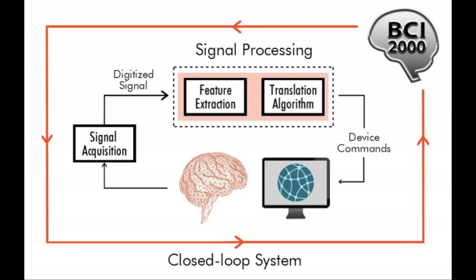BCI 2000 is very adaptable and can accommodate a wide range of neurophysiological experiments, including simple stimulus presentation tasks, neurofeedback tasks, and interface experiments. Additionally, it is very easy to add peripherals, such as the Xsense motion trackers.